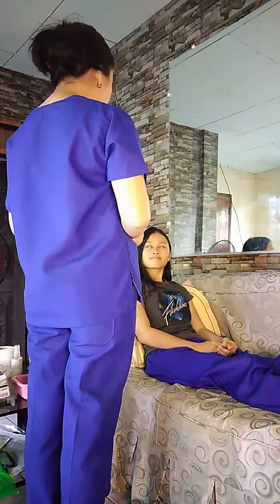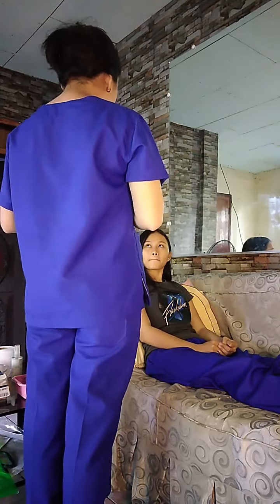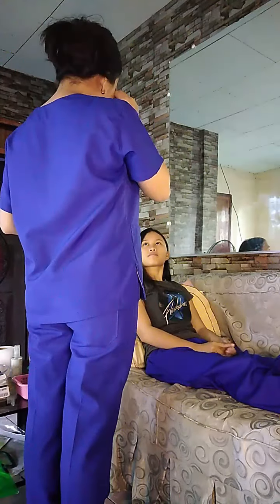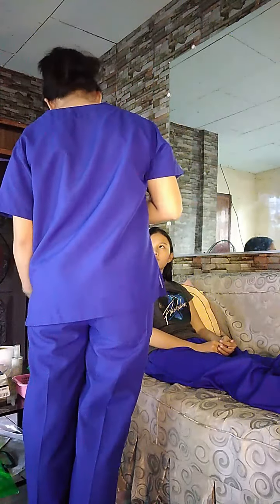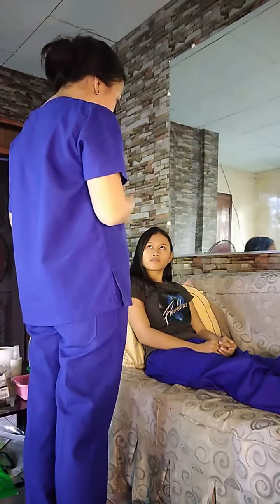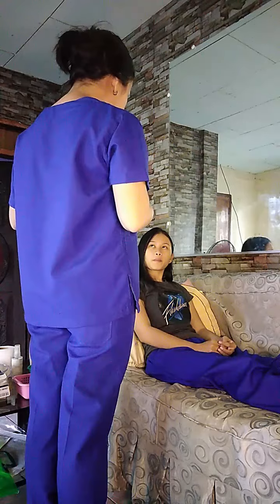So, ngayon po ma'am, magpo-perform po ako ng unang dalawang procedures. Ang una po ay insertion. So, ano nga ba ang insertion? Yung insertion po ng NGT involves, meron po akong tubing na ipapakita sa inyo mamaya. And then yung tubing na po, yun ay papasok sa inyong nostril, dito po sa inyong ilong, and then patungo po iyon sa inyong stomach.